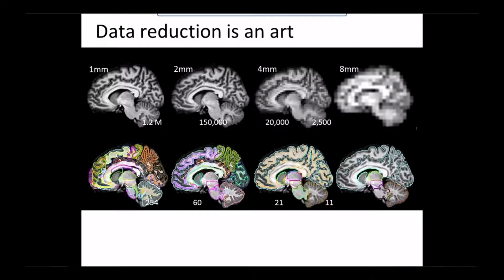And in the first column, there are 254 structures, and that 254 structures is an ontology of all the cortical and subcortical structures that you learn in neuroscience that you can actually see. So that would include all the white matter tracts that you can see, all the gray matter tracts. Things that you may have heard of in the literature, associated with memory would be amygdala and hippocampus and entorhinal cortex. Associated with motor would be cerebellum and caudate and putamen. So all of those terms. So we have this ontological representation, you can think of it as a coarse parcellation.